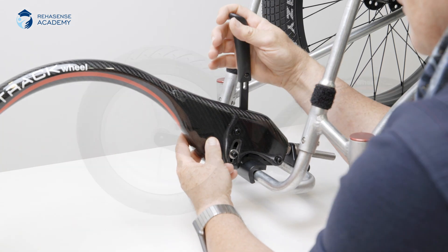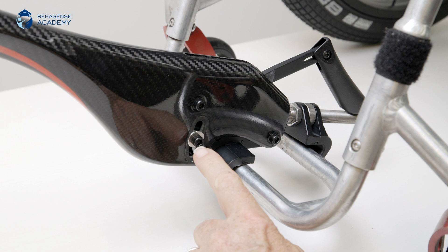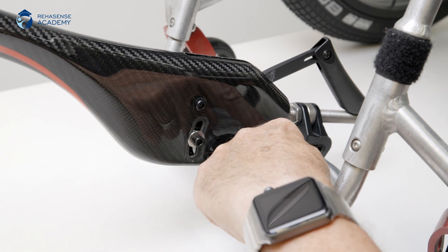As you notice, the track wheel is lifted from the ground when I lock it to the foot plate. We have to take care of this by adjusting the angle. Find the six screws, three on each side on the track wheel, and loosen them. This is done with a 5mm Allen key.